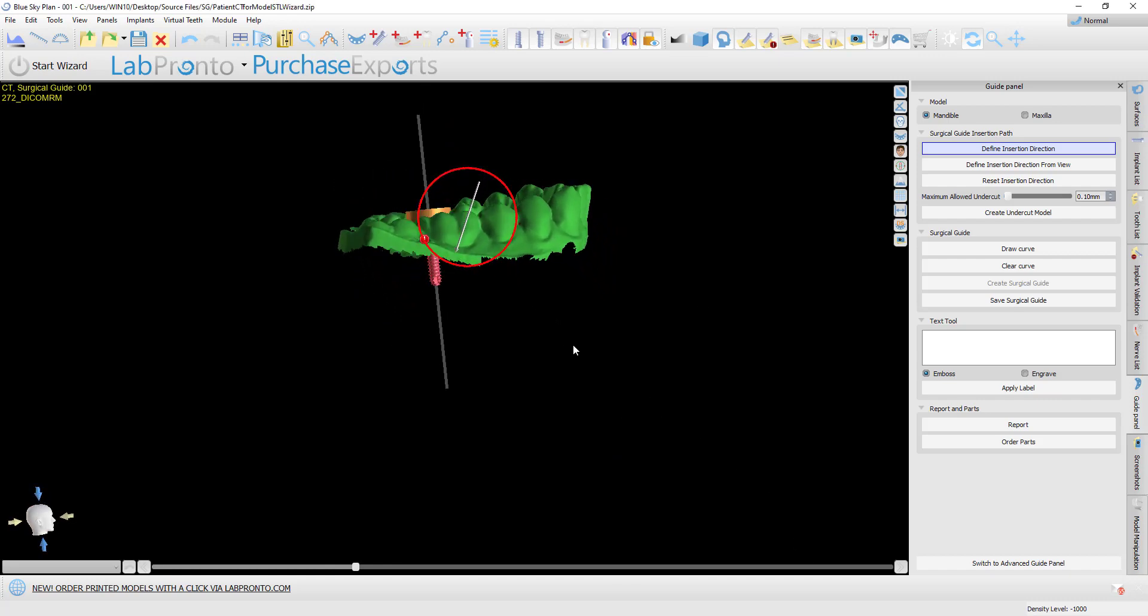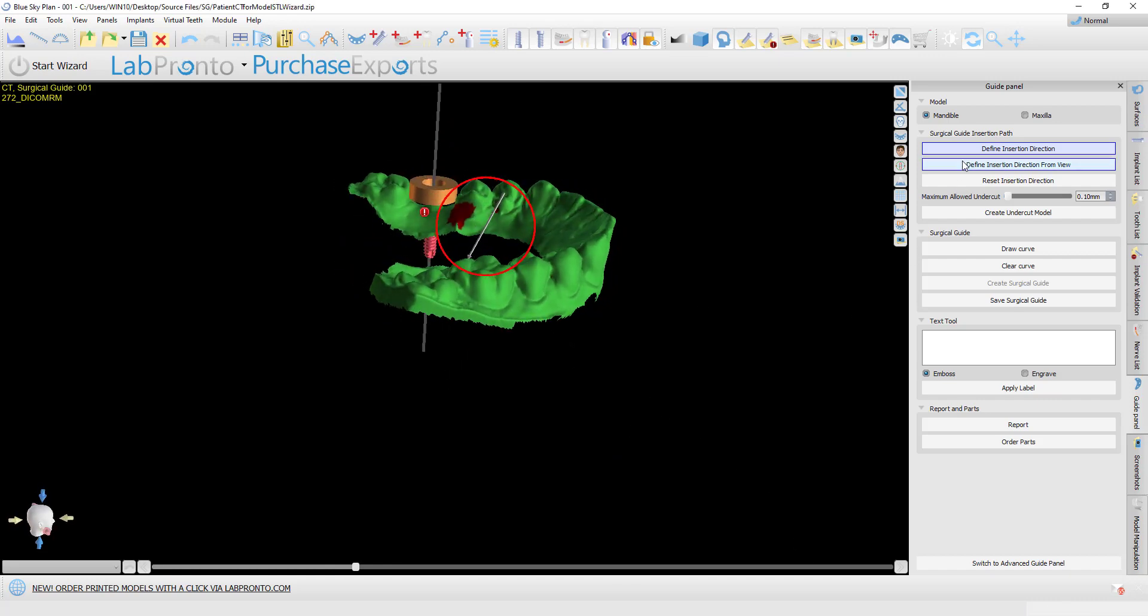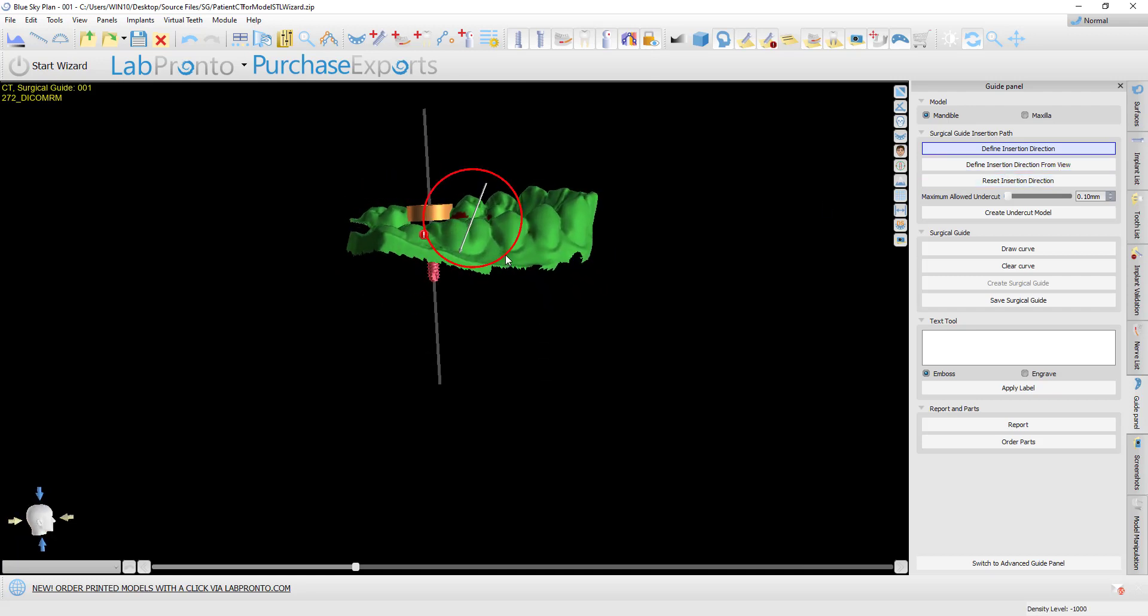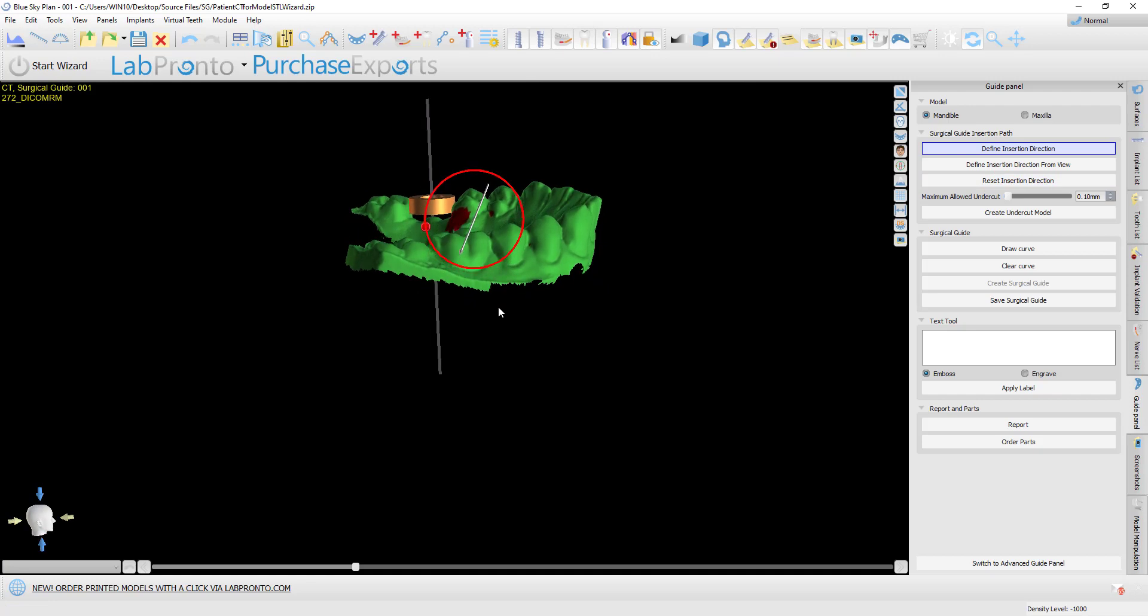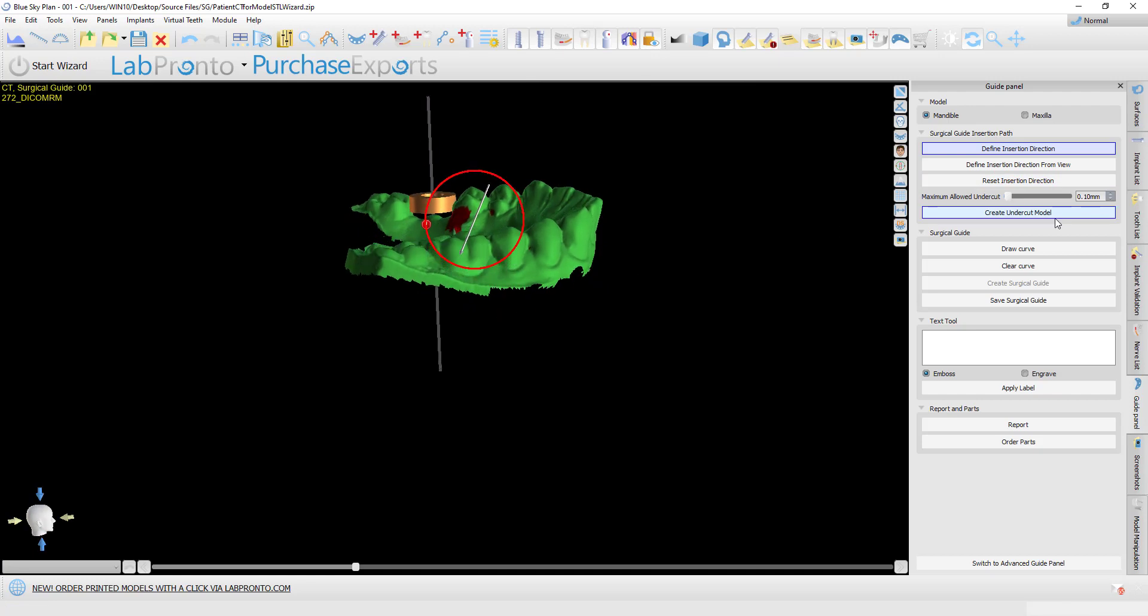Either way, whether defining insertion direction from the view or via the arrow, once you have the proper positioning, click 'create undercut model' to create the model with undercuts removed.